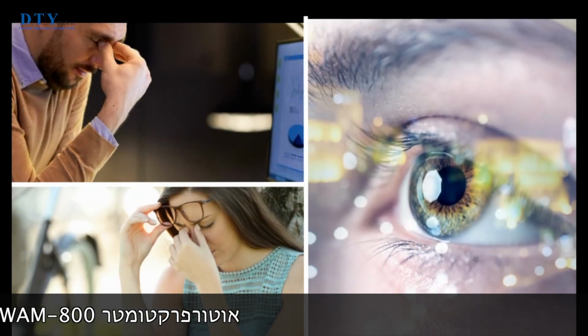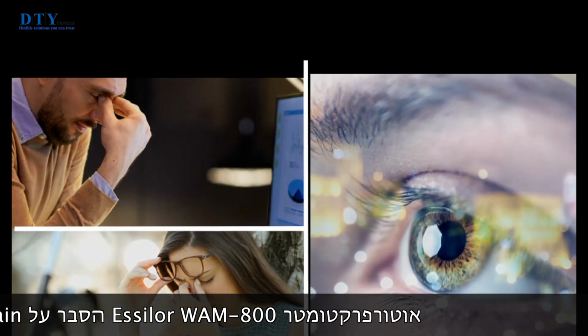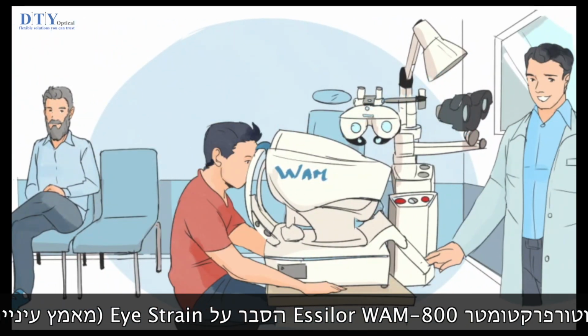Nowadays, lifestyle might lead to eye strain for a significant number of people. One of the missions of the eye care professional is to raise awareness on the impact of this visual discomfort. How can the WAM-800 help them to be more impactful?